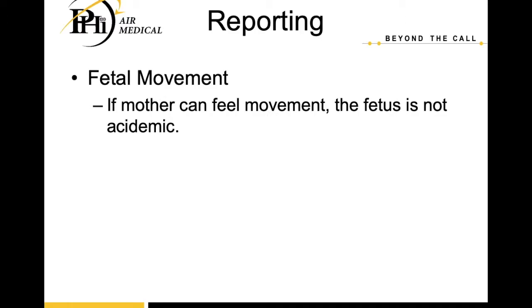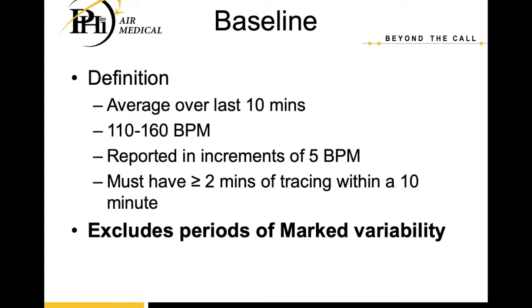Another important aspect of reporting is letting the receiving facility know if mother can feel movement, right? So we know that when a child or a fetus starts to become acidemic, they stop moving. And so if mom can feel baby moving, then we know that the fetus is typically not going to be very acidotic.